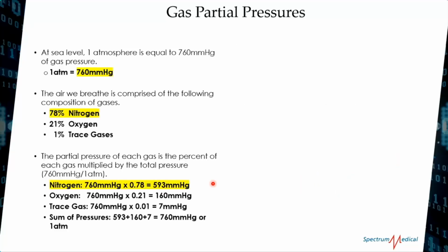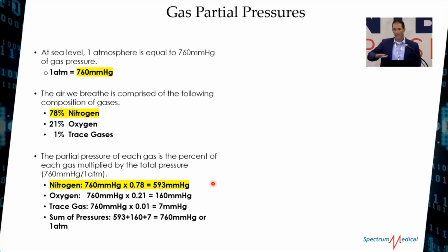All right, so we know there's a problem with air in our circulation and air getting to the brain, and we know that can happen with cardiac surgery. Now, to set the foundation to understand hypobaric oxygenation, I want to make sure we're all starting from the same level point of atmospheric pressure: 760 millimeters of mercury, the total partial pressure of all the gases in the blood. As I'm speaking about this, think about the total partial pressure of gases in the blood, which under normal circumstances is 760. Keep 760 in your mind, understanding that up to 78% of that is nitrogen, an inert gas that is not necessarily beneficial in our bodies.